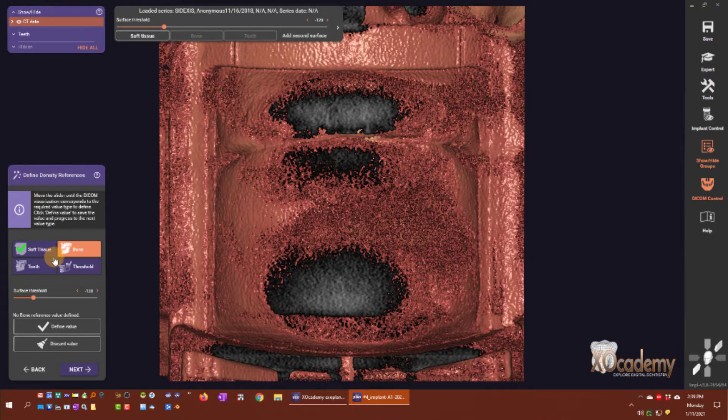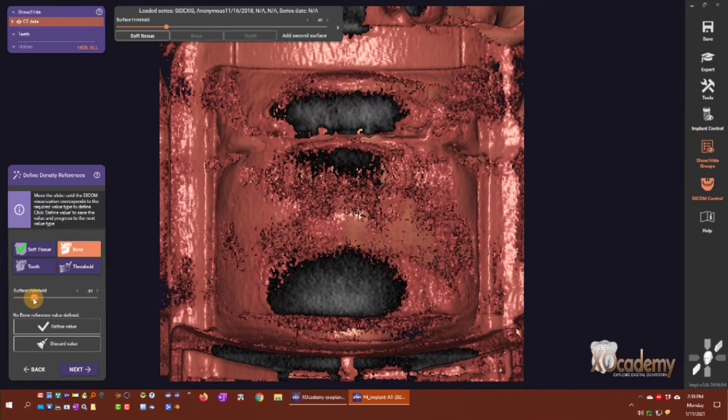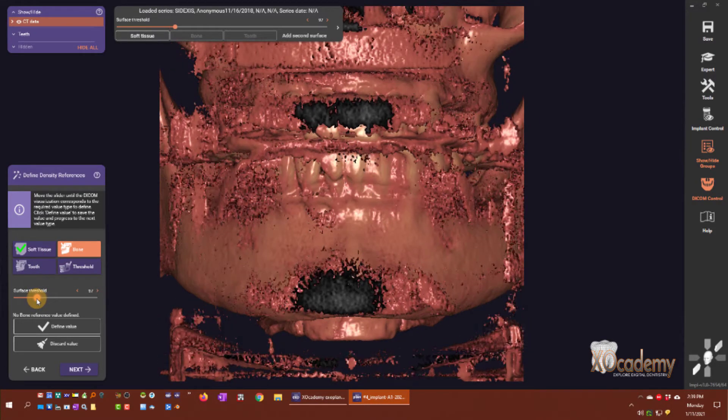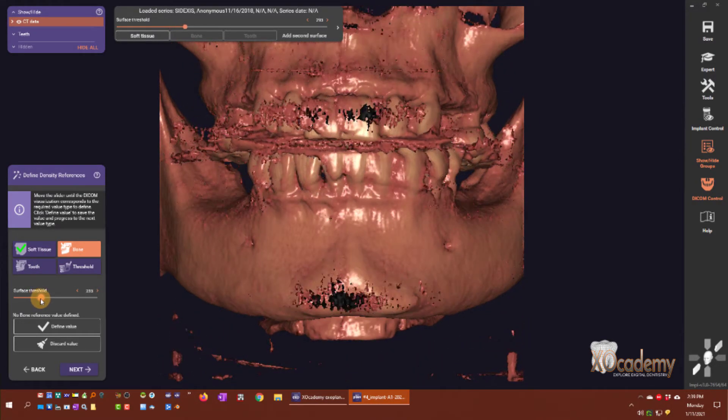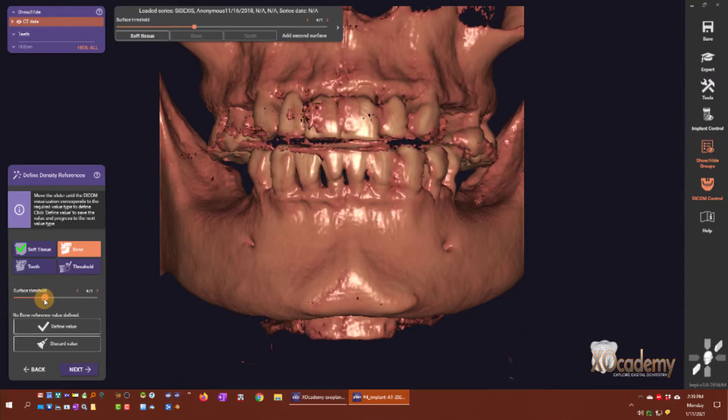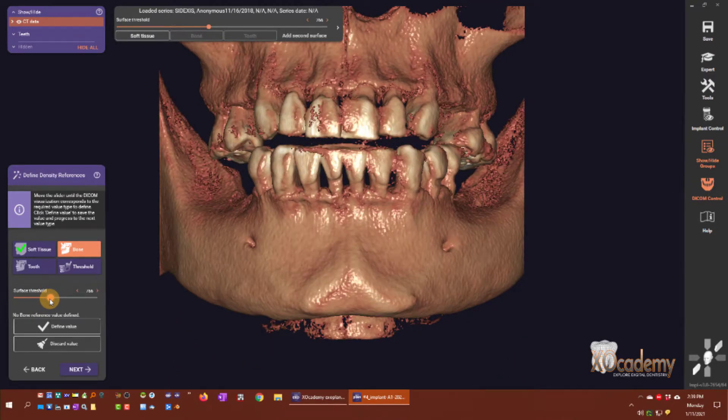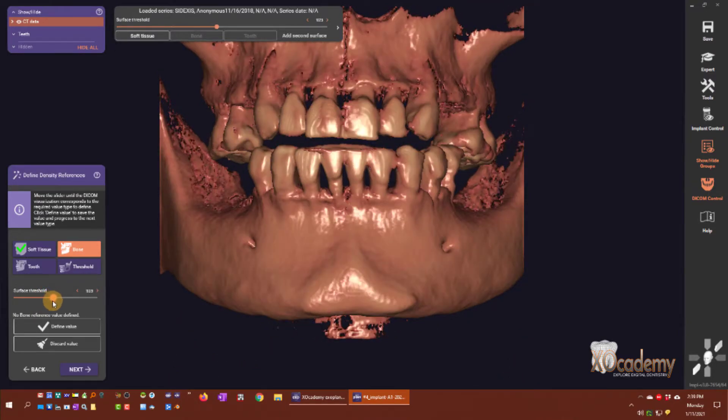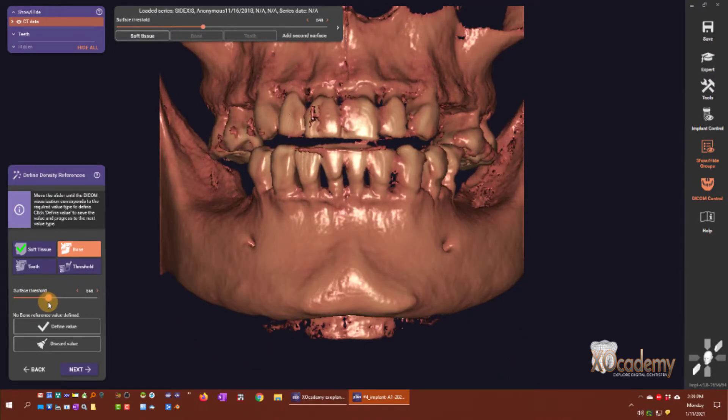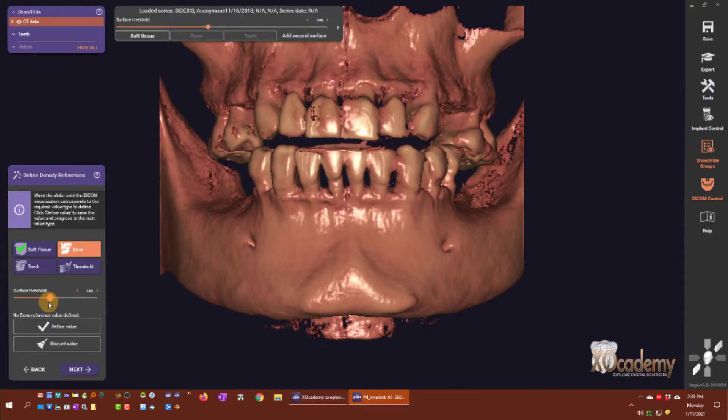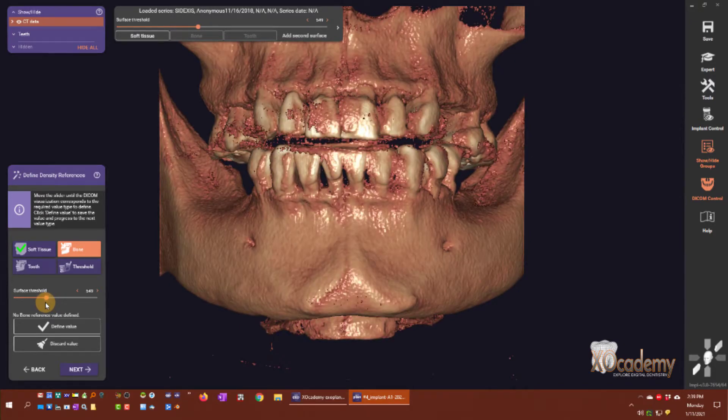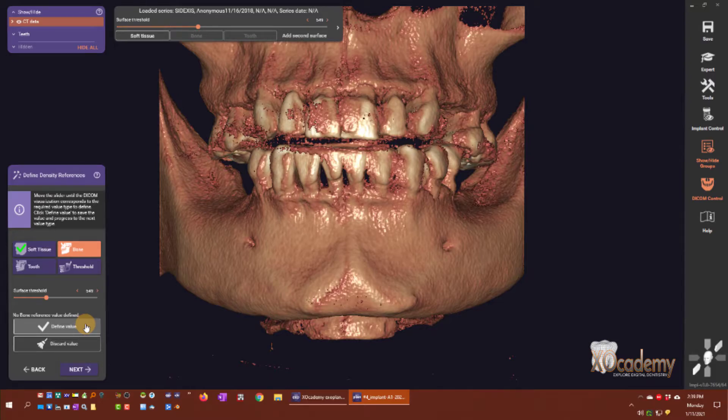Now we have bone highlighted. I'm going to move the threshold up to where I see minimal removal of bone. Maybe right there is my bone threshold, and I'm going to click define value.